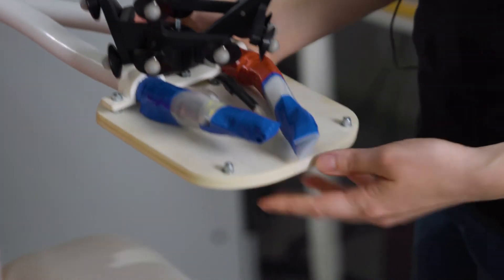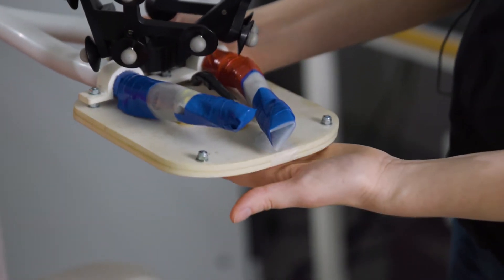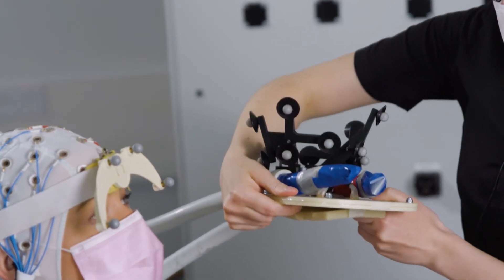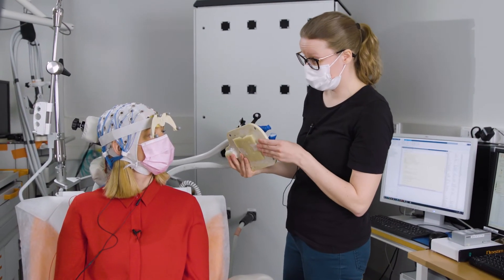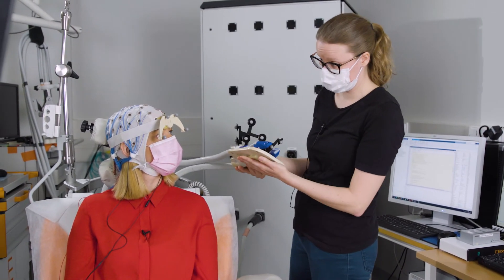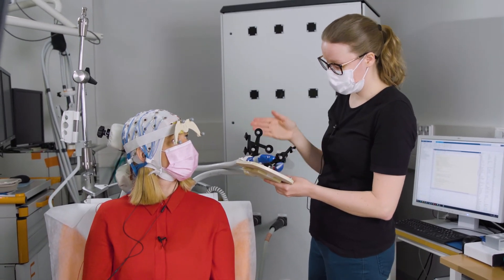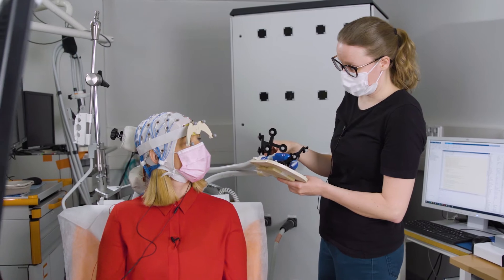Traditionally there is only one coil and you would have to rotate it physically and manually. Here we actually have two coils on top of each other, which means we can change the orientation of our pulse.